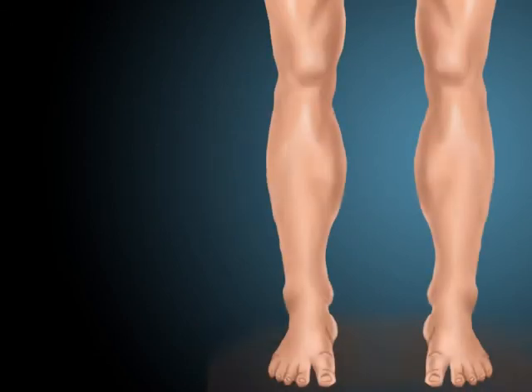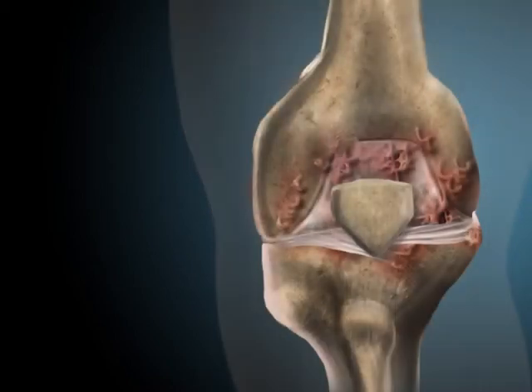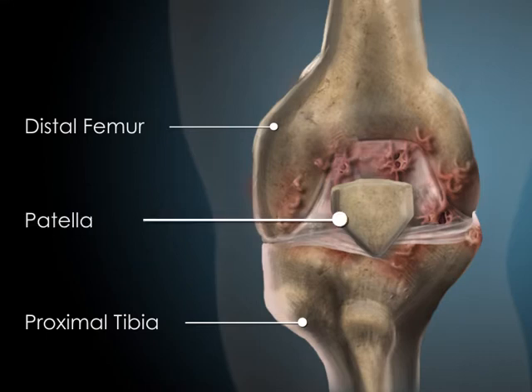A total knee replacement surgery is done to replace your knee joint with a prosthetic one. Bones that are included in the procedure include the distal end of the femur or thigh bone, the proximal end of the tibia or shin bone, and the patella or kneecap.